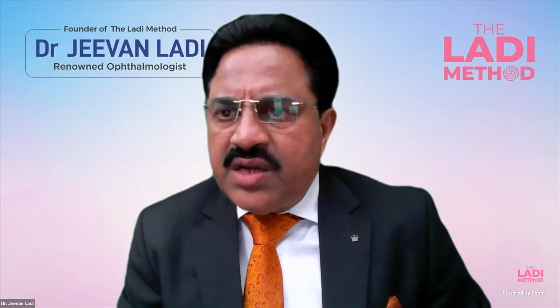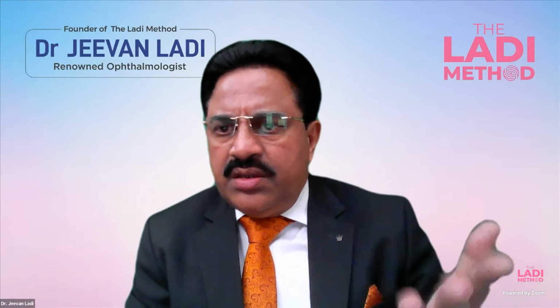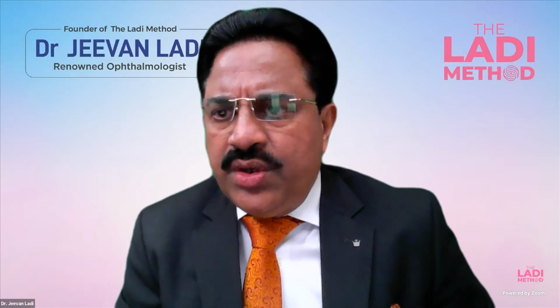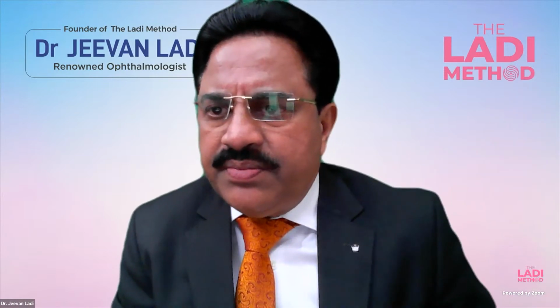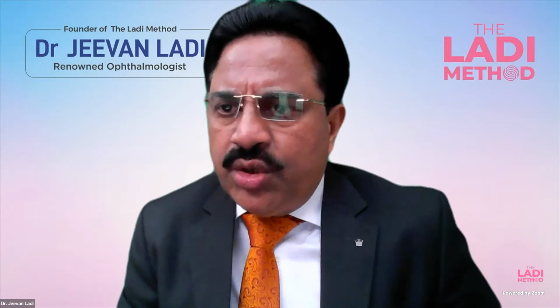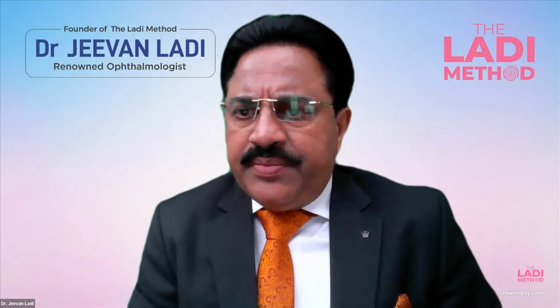There's a question from Dr. Arundhati Kalisudaya from Maharashtra. Can this be used for phakic IOL or secondary IOL, or whether it is feasible? Now, when you are using it for phakic IOL patients, we'll have to go into a different mode of IOL power calculation, which is there both in optical and immersion biometry. We can select that mode, and you can calculate the IOL power.